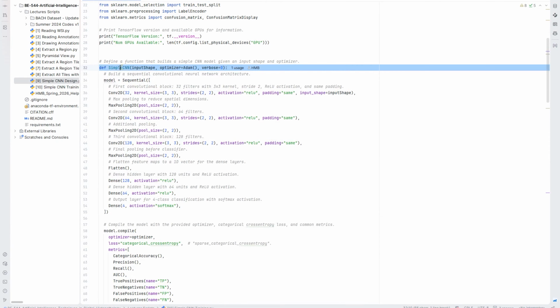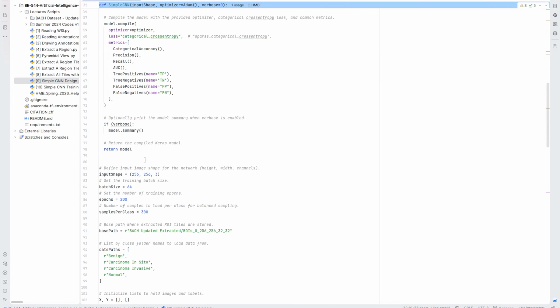So now we can call this function at any location to get the model which is ready now for the training. But before the training, we need to load the data and prepare it well for the training process. And preparation means you can apply different pre-processing techniques, such as resizing the images to make them in a unified shape, splitting them into training and testing as discussed.